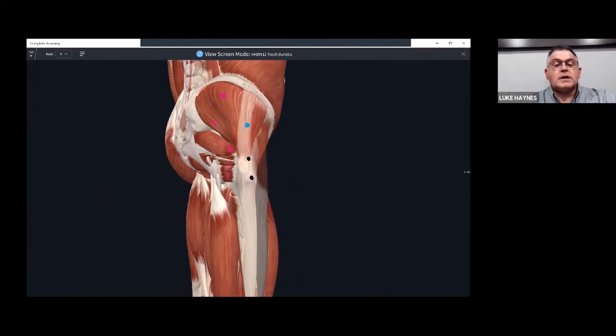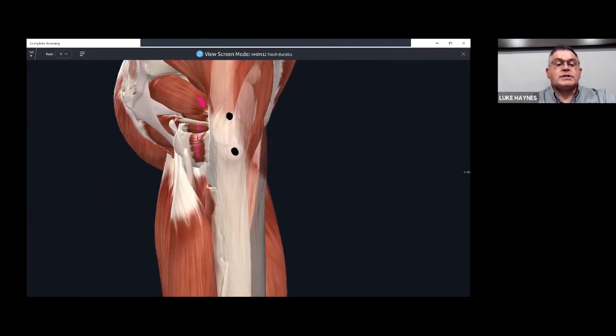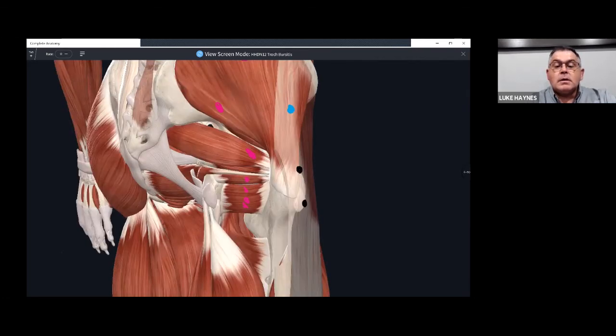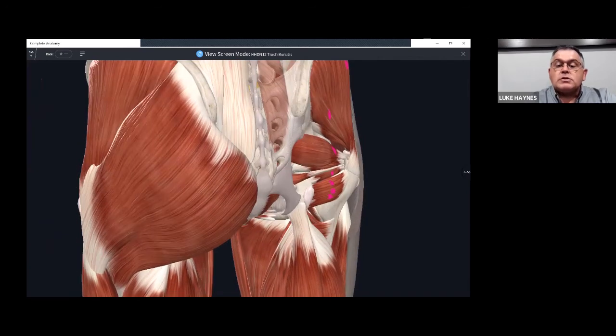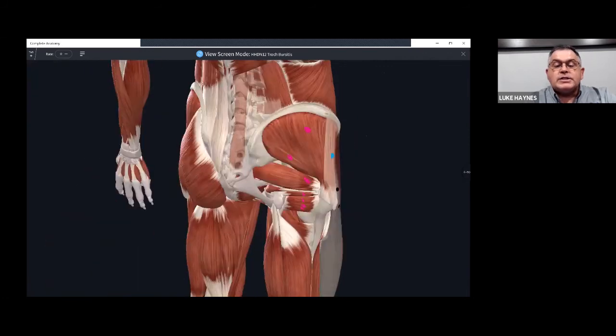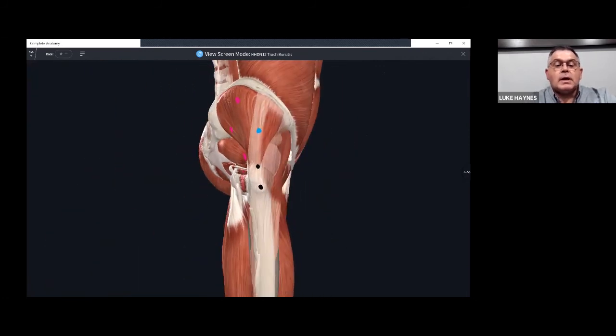Okay, again, our primary is just a direct needle down to the trochanteric bursa of gluteus maximus and medius. There's also one for minimus that's tucked way away in there. We're going to catch that one as we needle two finger breadths above, superior to the apex here, so we don't make a separate needle insertion for that.